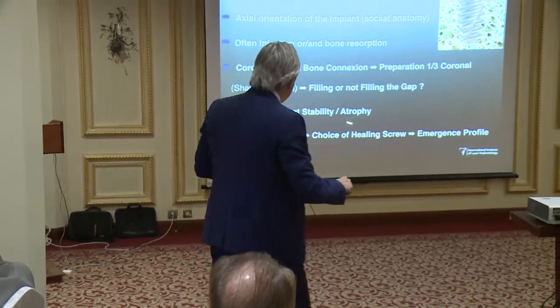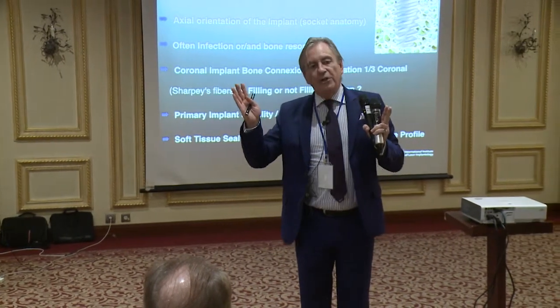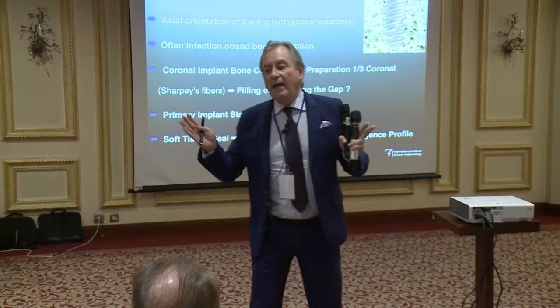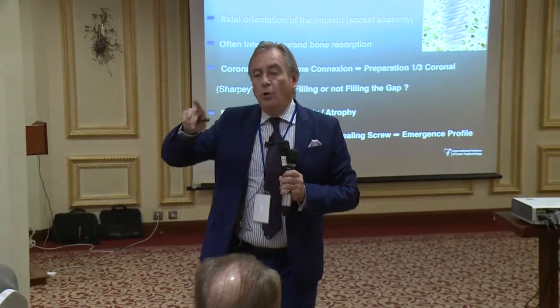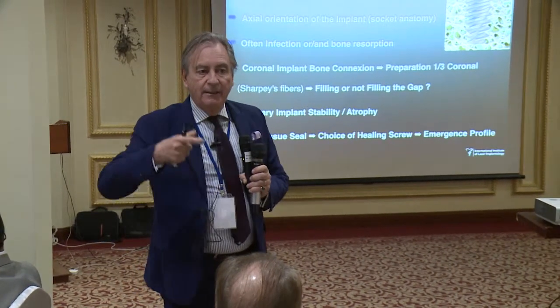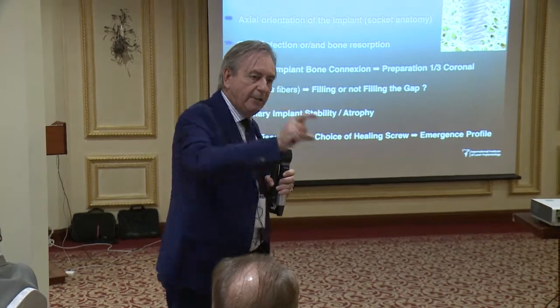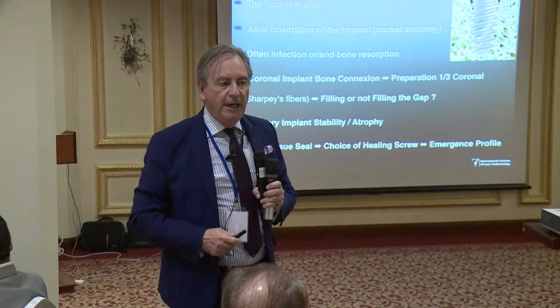You will try by this emergence profile to fill up this gap. And the right choice of your abutment or healing cap will direct the choice of both diameter and height of your prosthodontic connection.